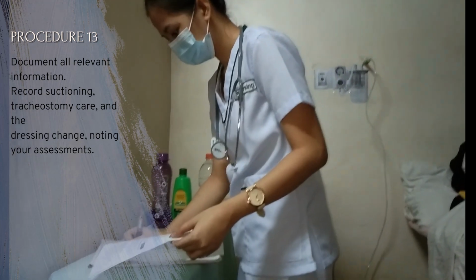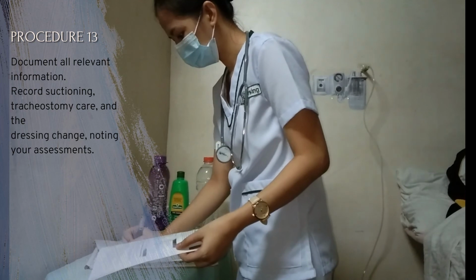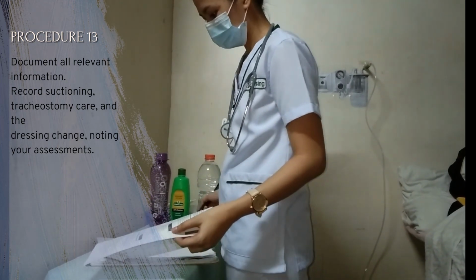Document all relevant information. Record suctioning, tracheostomy care, and the dressing change, noting your assessments. Accurate and timely documentation and reporting promote patient safety.